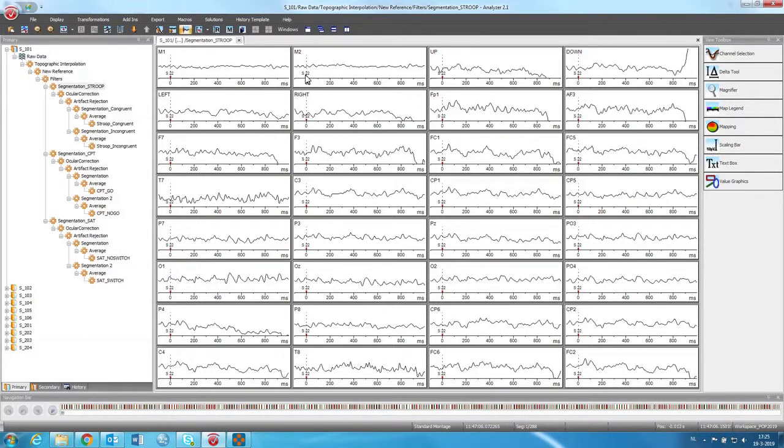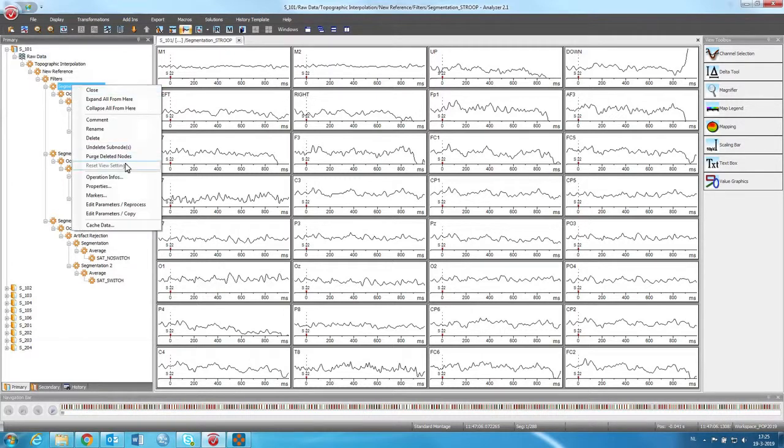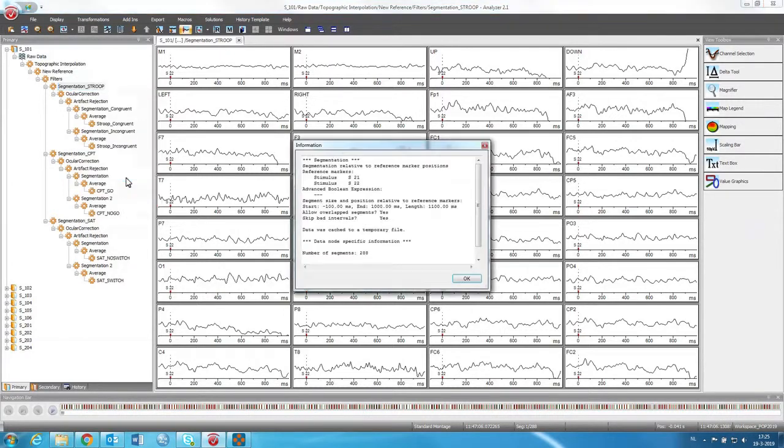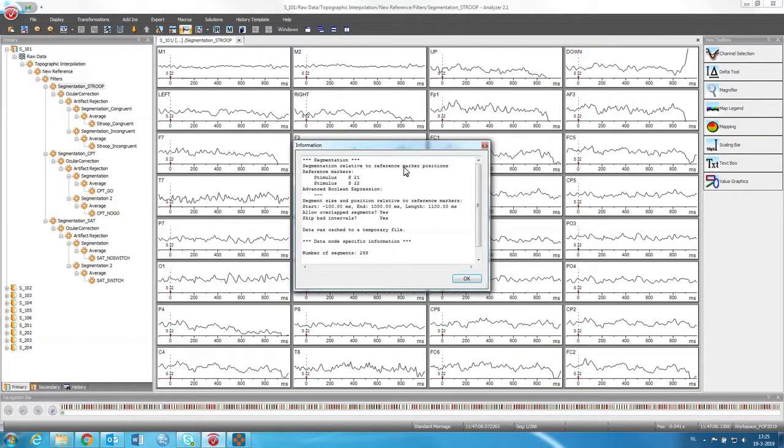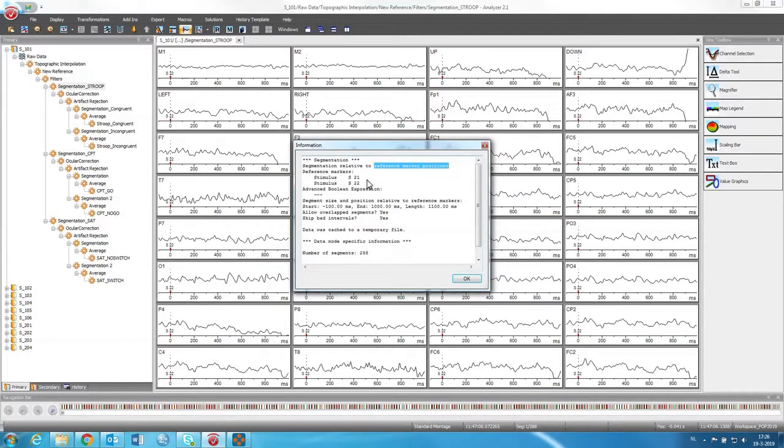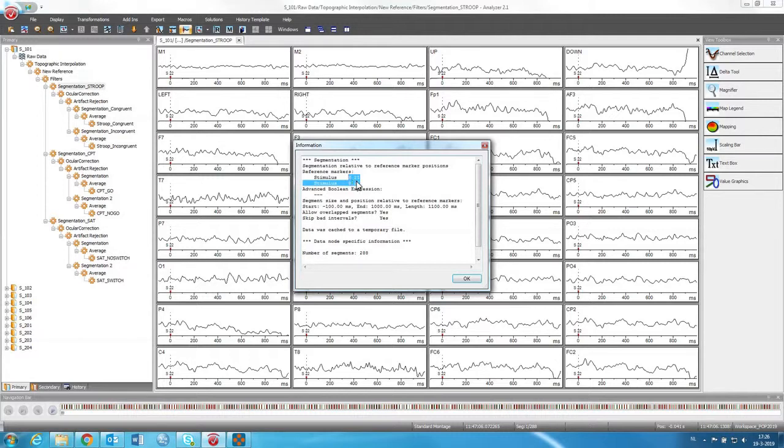Here you can see that it is around the stimulus S22. You can see here for operation info what was done. The segmentation here was done according to a reference marker. The reference marker is the trial, or the trigger, or the stimulus. This is just different names for the same thing. And here they call it a reference marker.